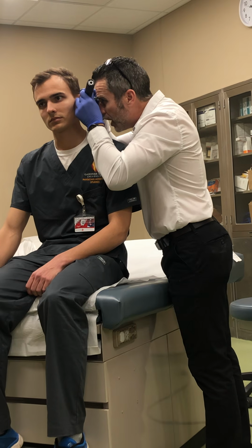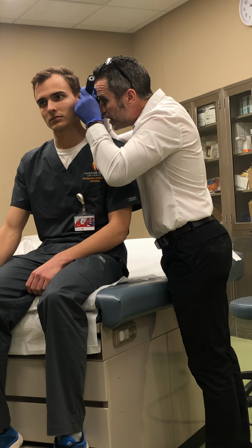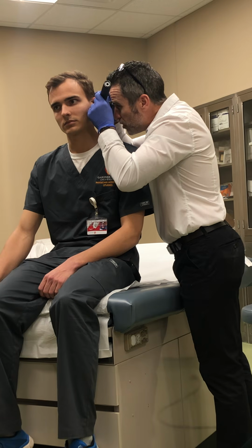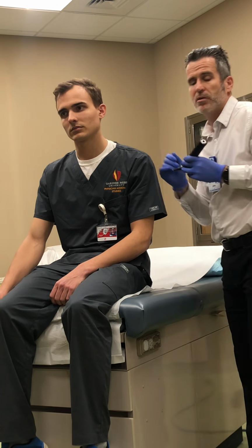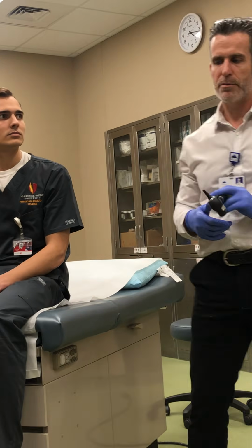So I come, I look, there's his flaccida, tensa, there's a light reflex you can see at about 8 o'clock. You can see that it's translucent, it's pearly gray, umbo, malleus, all those things you can see. He's got a pretty clear ear canal. No signs of otorrhea or any type of debris in there except that little bitty piece of wax. You'll see hair in people's ears.